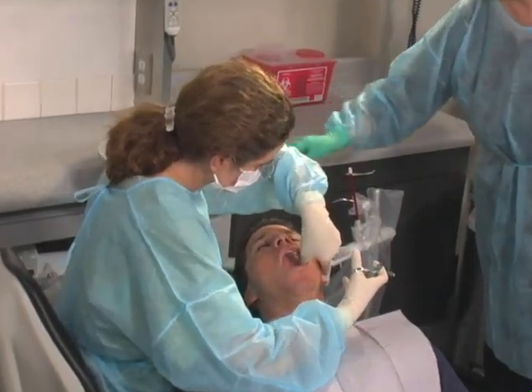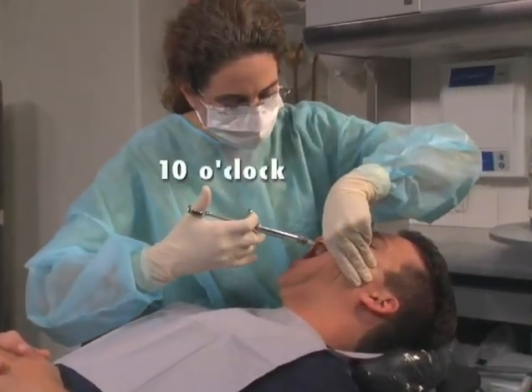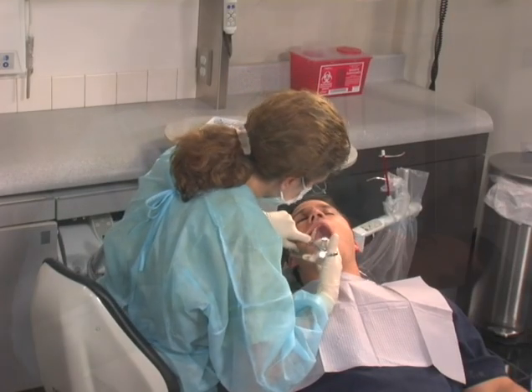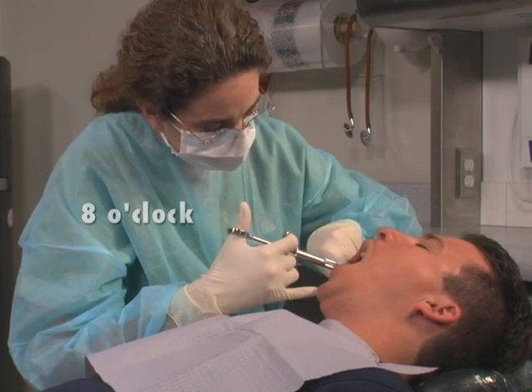For the left PSA nerve block, a right-handed operator should sit at the 10 o'clock position facing the patient. For the right PSA nerve block, a right-handed operator should sit at the 8 o'clock position facing the patient.